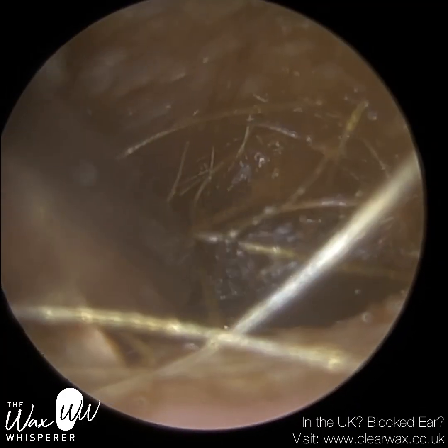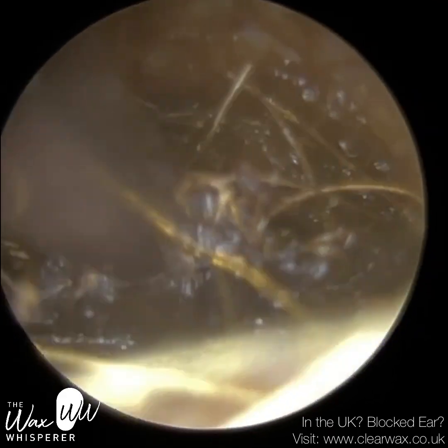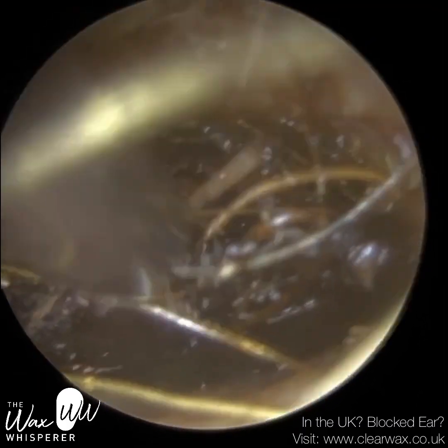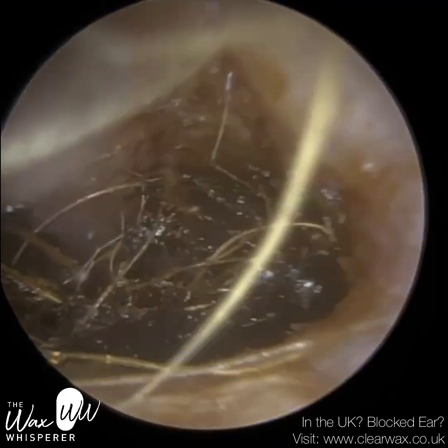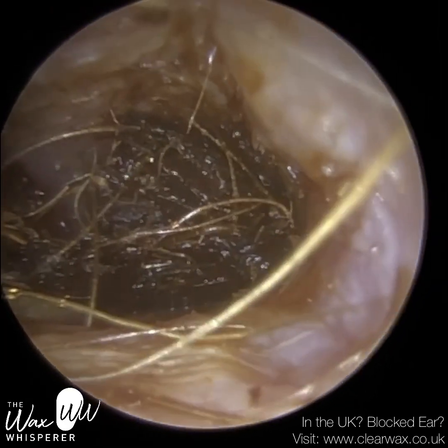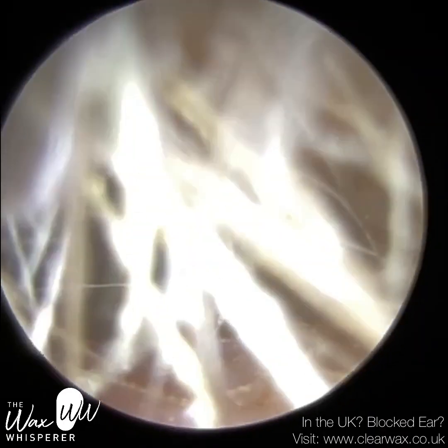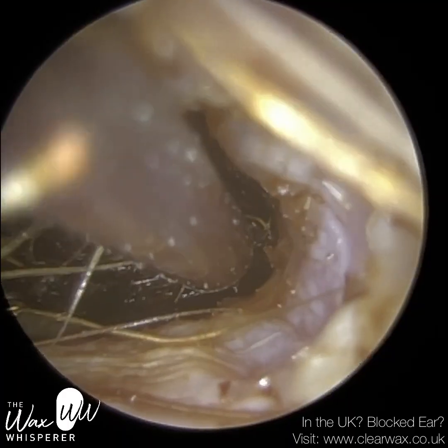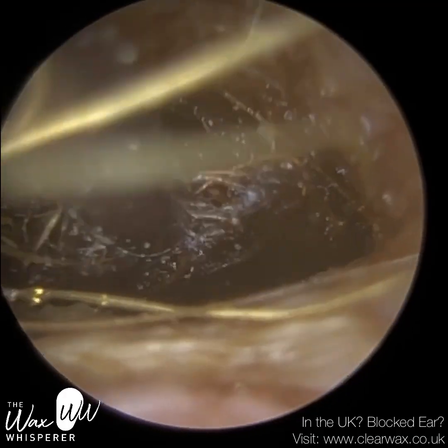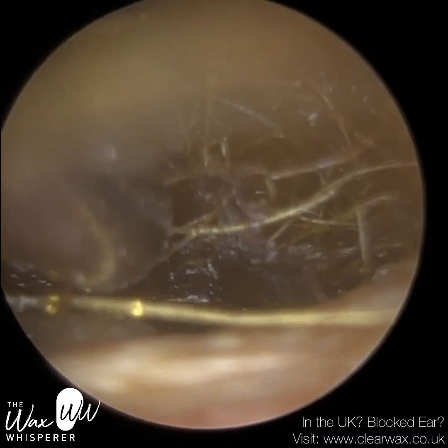I'm assuming, as you can imagine, barbers in the UK, it doesn't really cause them an issue, but obviously barbers are not performing medical procedures, and I have been told that trimming hairs can cause other contamination issues in the room, and it just makes the whole process more complicated. So that's not a hindrance if there are some obstacles there, and we're more than happy to overcome them for the benefit of the patient. But that's not my primary reason not to, although obviously it can be a hindrance. It's just I don't see the need. And as you can see here, this wax is matted, it's all hairs over it, and it can make it more complex to remove.